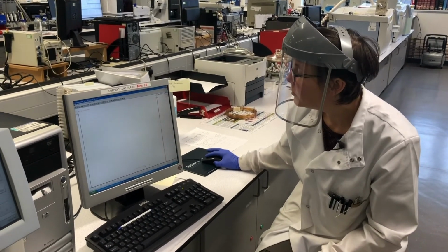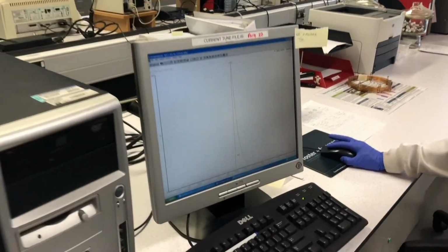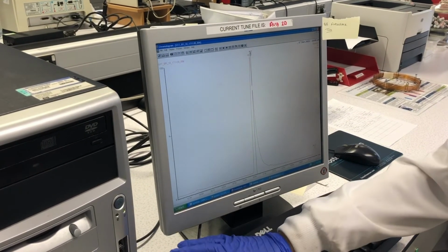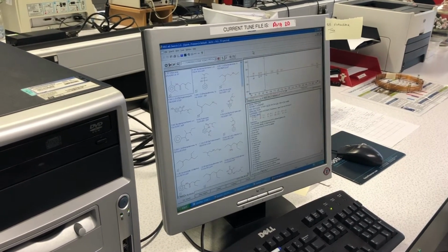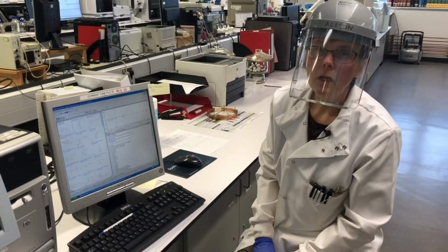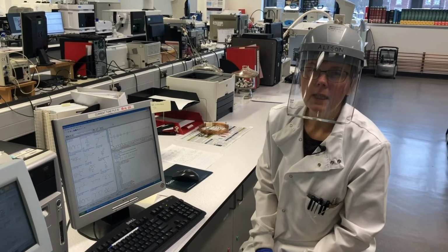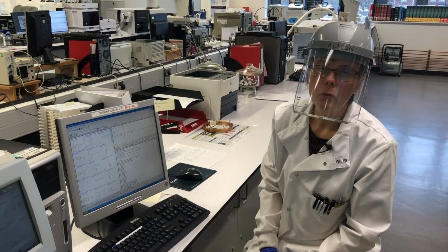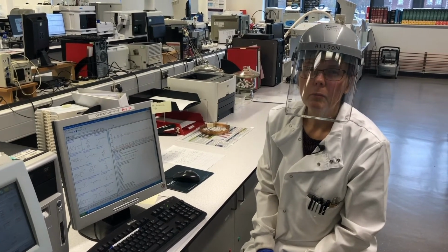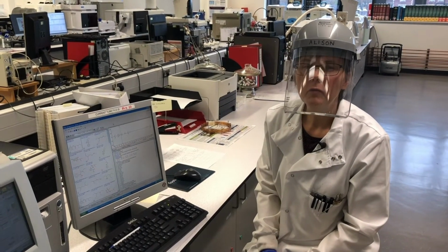If we look at the chromatogram and look at some of these smaller peaks that I've now zoomed in on, again, bringing up the mass spectrum here and searching against the library, we can now see that this sample has been cut with lidocaine. This will allow us to potentially link a dealer to a whole set of samples that's seized from different users and potentially bring better charges against our dealer. This is really useful information.